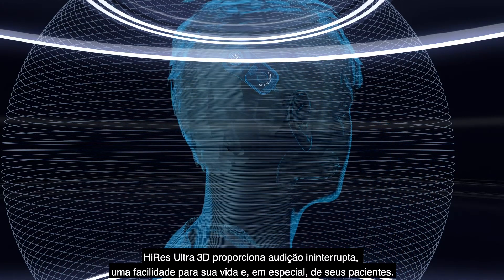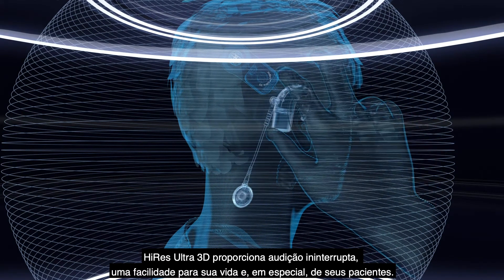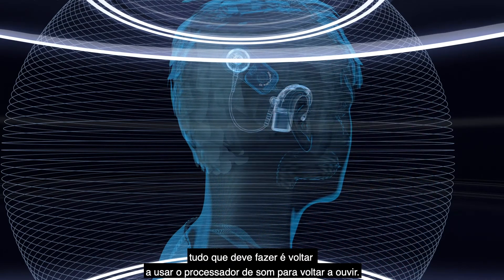Hi-Res Ultra 3D provides uninterrupted hearing to make life easier for you and especially for your patients. When the scan is done, all they have to do is put their processor back on to return to hearing.